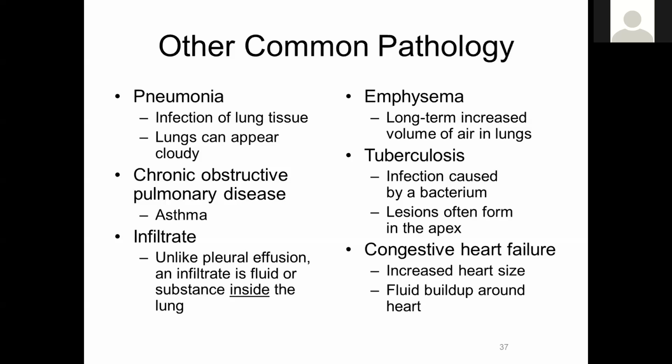Congestive heart failure is another very common pathology. This means the heart is no longer as efficient at moving fluid. So the heart tends to increase in size. You have a fluid buildup around the heart. And that shows up a lot brighter on your X-ray.